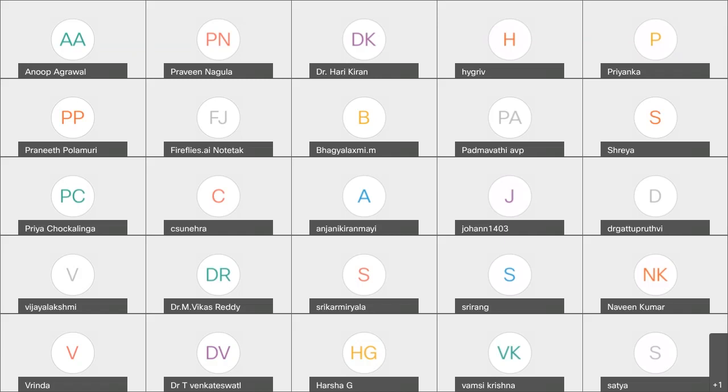we are looking at some other causes of scarring to explain, because the scarring is very impressive. It's very extensive in this particular patient, and it is disproportionate to the echo findings. But one needs to remember that these days we definitely know only three clinical syndromes, that is coronary ischemic cardiomyopathy, dilated, and hypertrophic. But in reality, there are so many subsets that we are not aware of. With cardiac MRI, they are coming forth, which are substrates for sudden cardiac death.